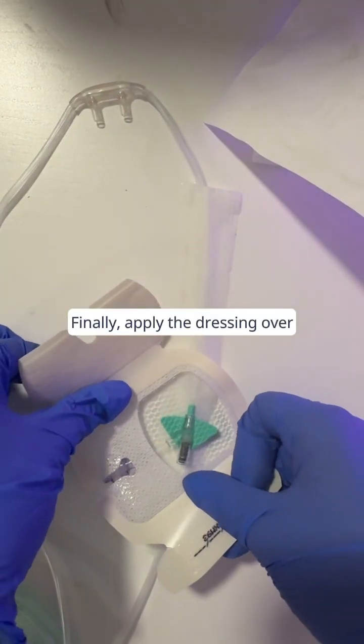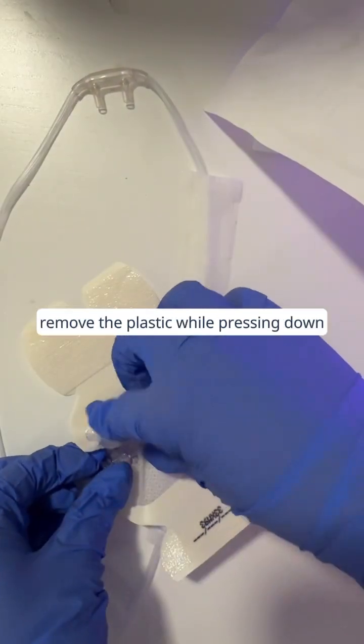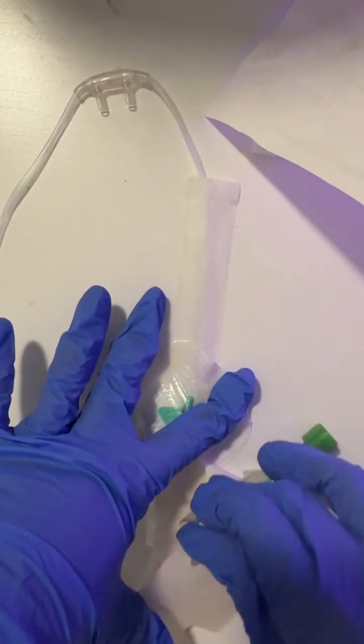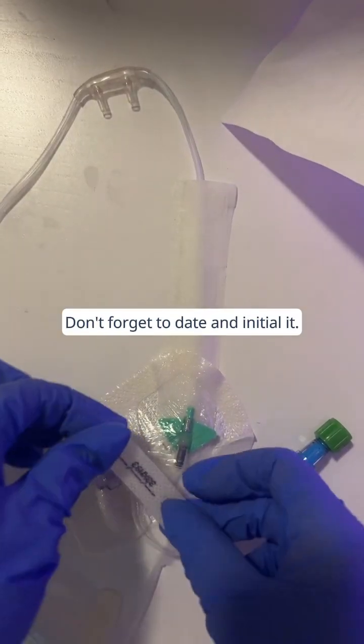Finally, apply the dressing over the insertion site. Position the port securely, remove the plastic while pressing down, and secure the dressing.